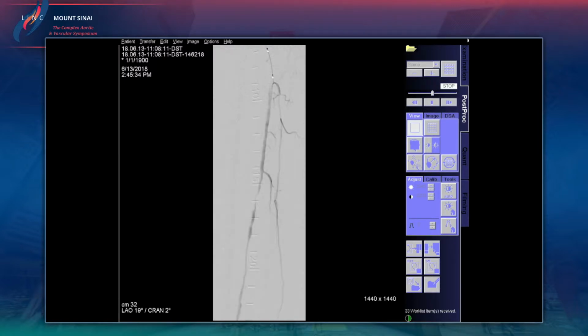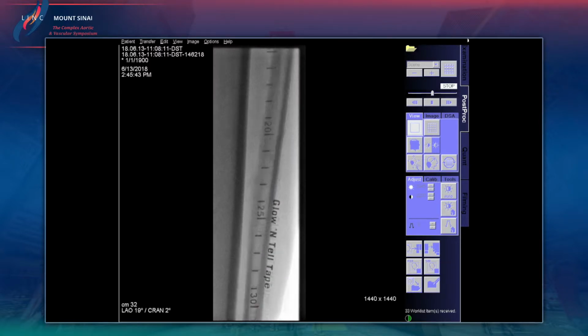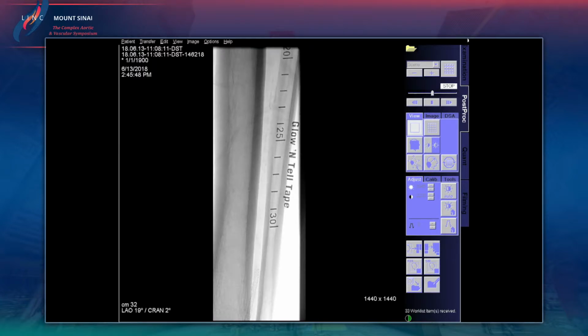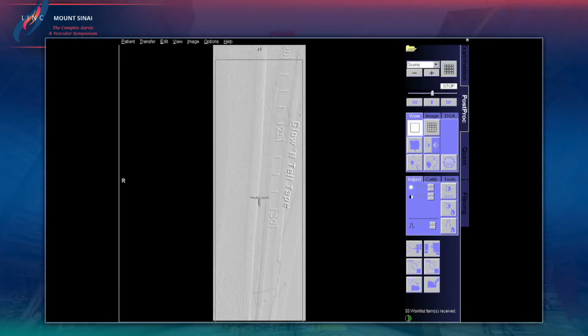So focal, diffuse, come down. Right there. I think you're right. I do see it now. There is one there. Yeah. Very diffuse there. And then at the level of the stent, it looks like there's some ISR. Now show me the foot.